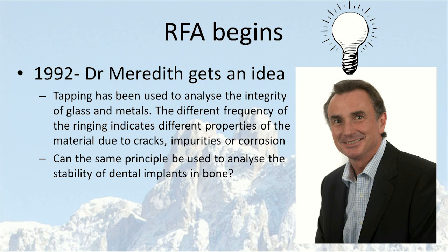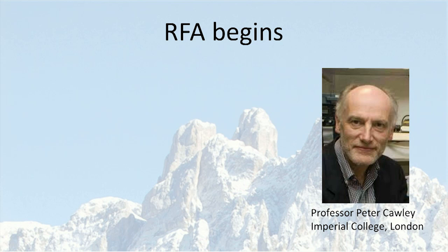By tapping the wheel, if there is a high tone, a high resonance frequency, we know that there is no corrosion, no cracks. But if the resonance frequency is low, we know there is something wrong with the metal and the train wheel, which needs to be changed. So he thought that maybe we can use the same principle to analyze the stability of dental implants in bone. So Neil is the inventor, but together with Professor Peter Cawley.